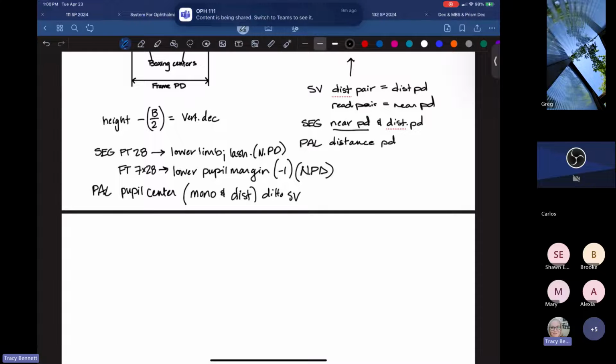Knowing that, it might be a good idea to go back in and watch the video of the overview of the surfacing and finishing process so you can try to associate those individual names and titles. So, selecting the lens blank and then lay out and block it, generate it, fine and polish it, all those. So just be familiar with those.